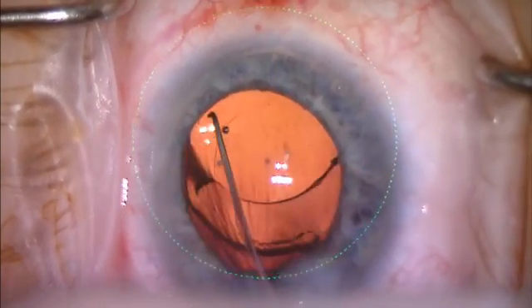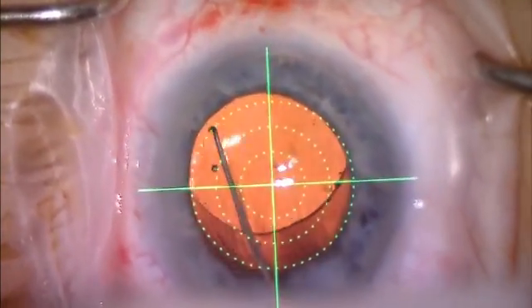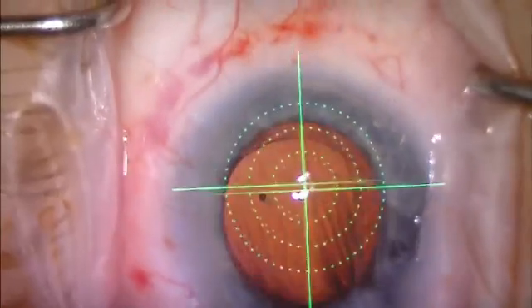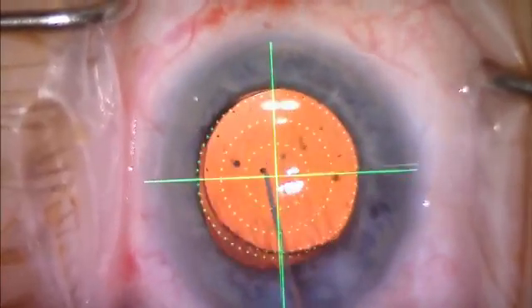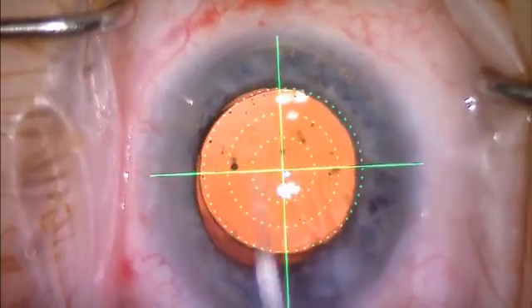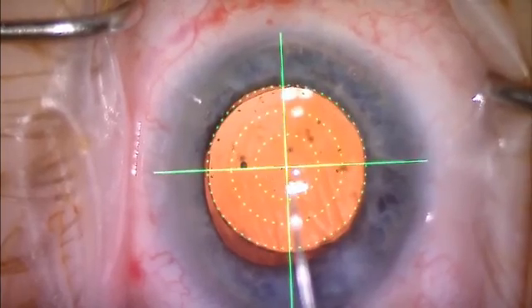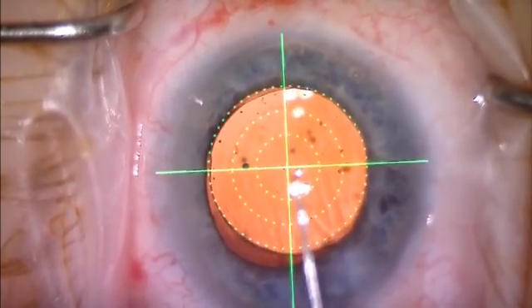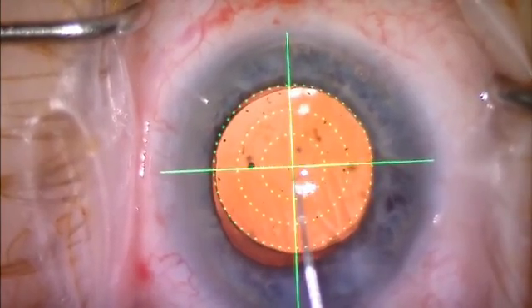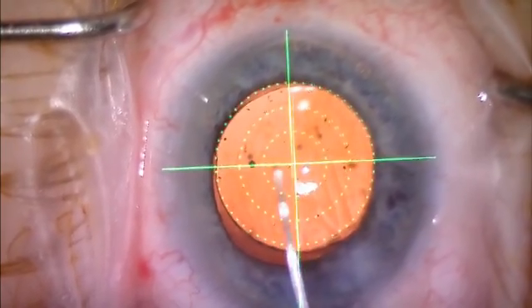Traditionally, we have always rotated restore lenses to 12 and 6 and nudged them a little bit nasally for centration. However, you can see now with VERION, there's no more guessing. We know exactly where the axis is, or the center of the eye, for this lens. We can set that centration on the pre-op pupil, which is what I prefer to do, or you can set it on the visual axis.